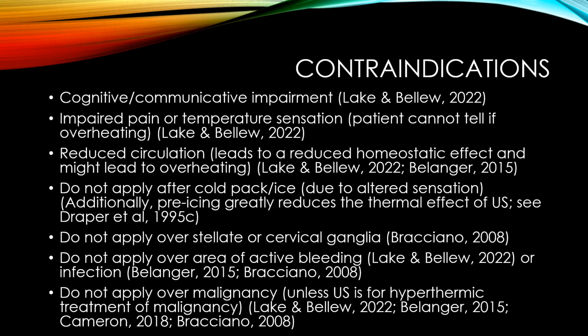Now on to the contraindications. Remember, these are the situations in which you simply will not use ultrasound. If your client has a cognitive or communication impairment, so they can't tell you what it's feeling like, that would be a contraindication. Similarly, if they have impaired pain or temperature sensation, so they can't tell if it's overheating, you would not use therapeutic ultrasound.